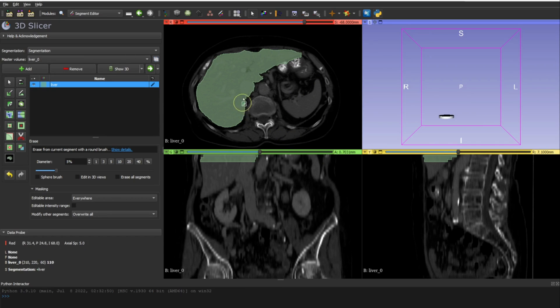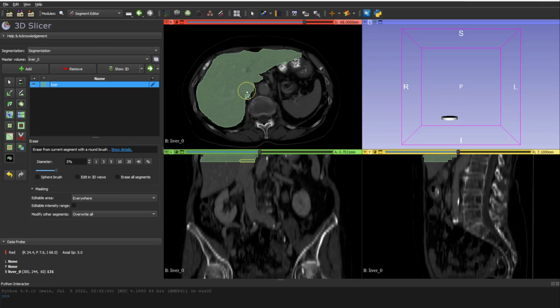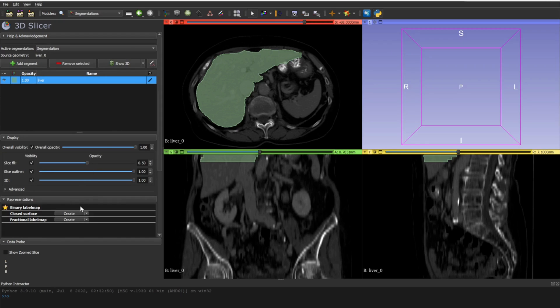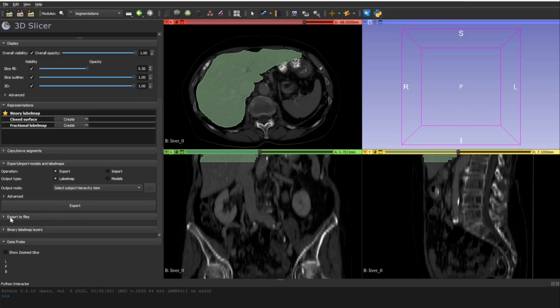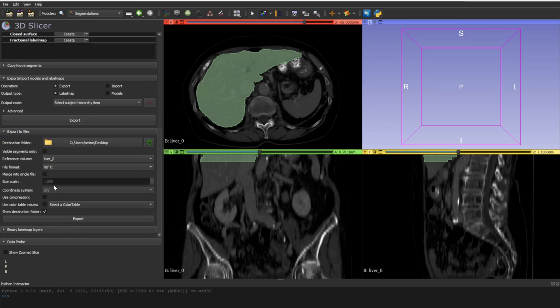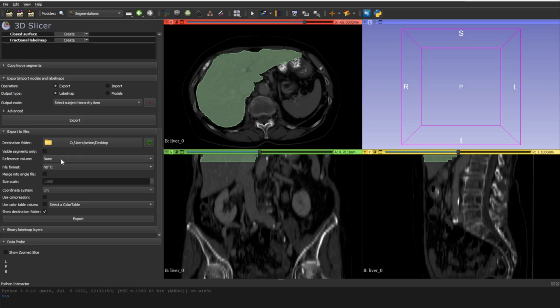Now let's say you've completed all the slices — I only did three, but the same applies to the full scan. Now to export your file, click on the green arrow here, then go to 'Export to File'. There are some parameters to set: first, choose the save location. Then, very importantly, set the Reference Volume — by default it may be set to None, which you must not leave.